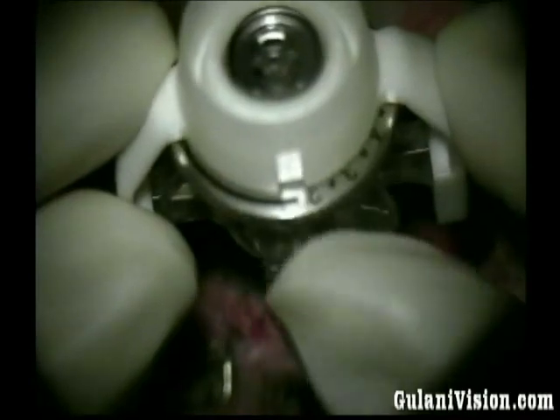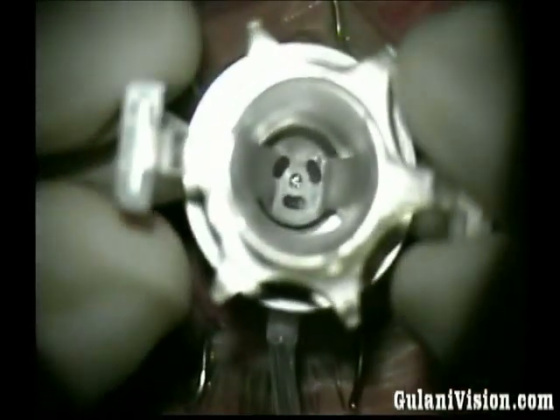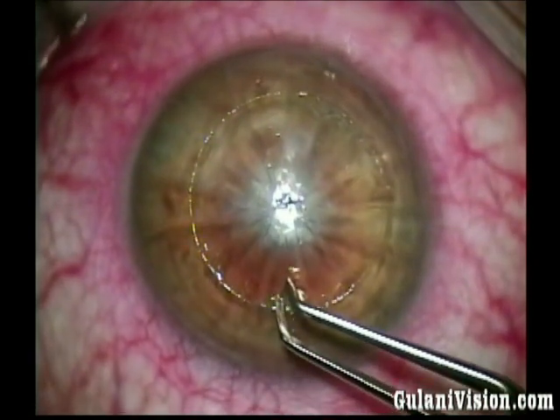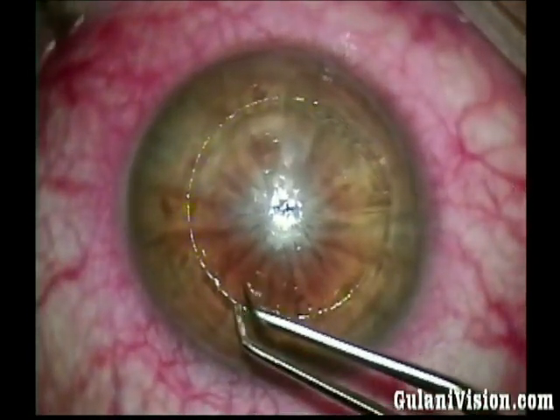And now I'm determining at the notch what my depth of definition would be, in this case 200 microns. I'm now placing the trefine to make sure my marks are preset, not going to cut through the arcuate incisions into the eye, but stay just outside. And I'm happy with the mark. I proceed with vacuum. Rotate gently clockwise and it will stop at the depth that you have determined. I'm observing now the uniform circumferential definition.